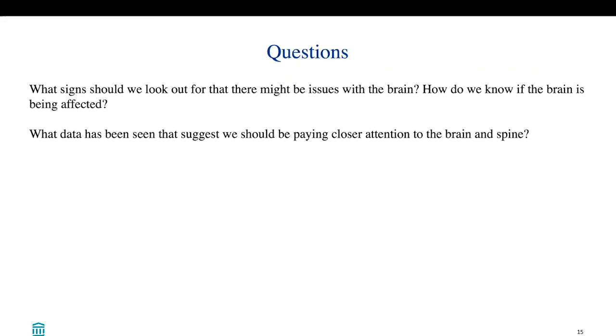As for the spine, that's a little different as we are focusing on patients with features of tethered cord. However, due to the frequency of tethered cord in those imaged, we are beginning to pay closer attention to tethered cord in Myhre syndrome. Additionally, after reviewing chest CTs, which again provide some views of the spine, we're beginning to see more radiographic findings that when paired with symptoms may correlate to a tethered cord.